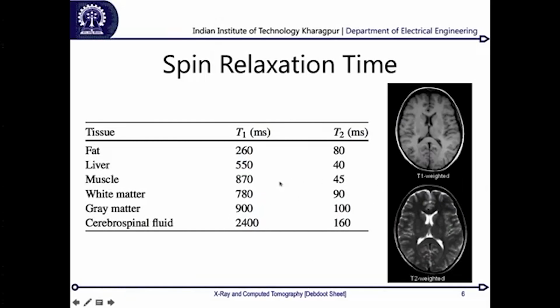Now, if you look over here, this is the lining of the meninges around the brain, and since that is made out of a lot of fat, it still remains white. If I look at the gray matter and white matter over here, they also make a difference, in the sense that white matter is lower and gray matter is higher, and they are inverted over here.